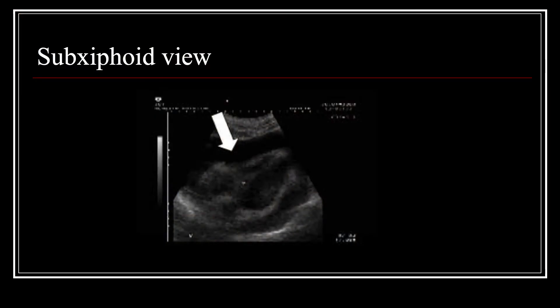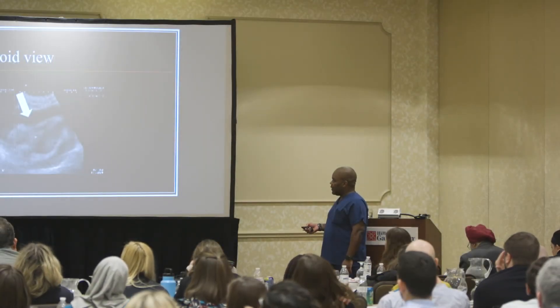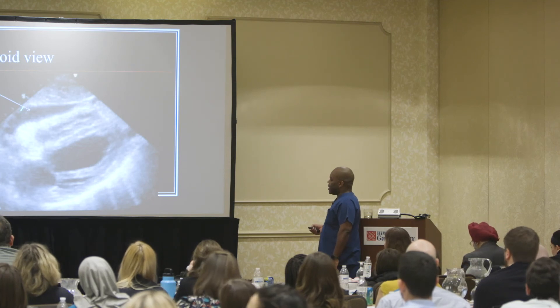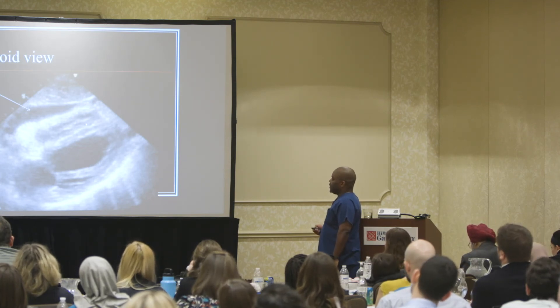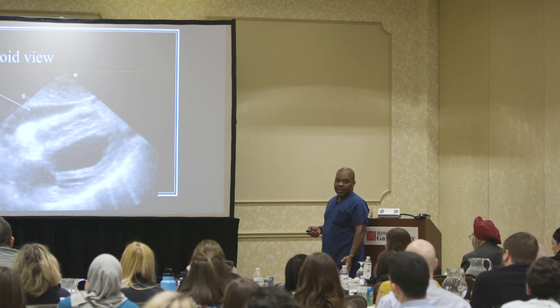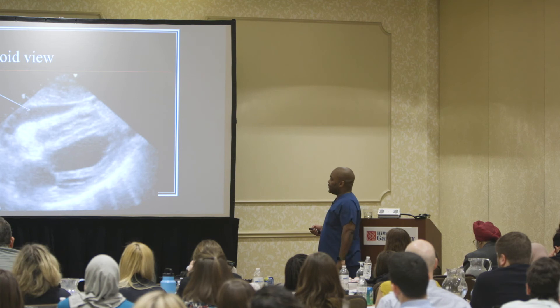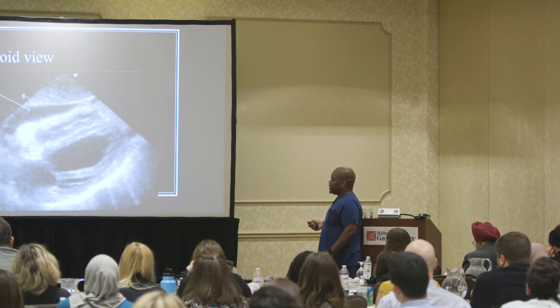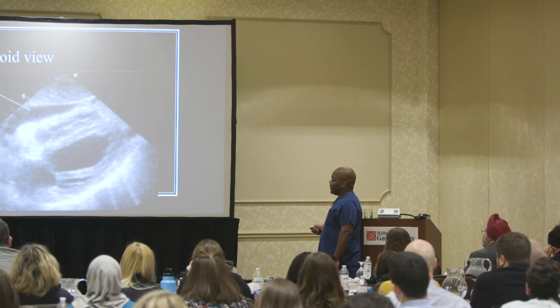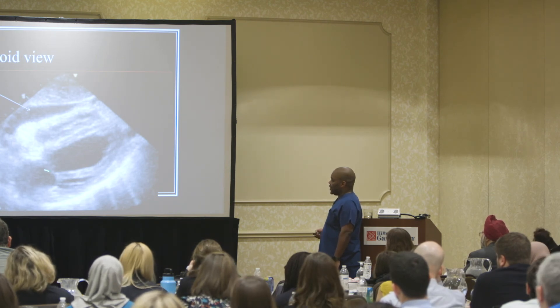Here's a sub-xiphoid view showing a very large effusion around the heart. You can see the right ventricle is collapsed and you cannot see the right atria at all. You can see the left ventricle and left atria. Here's an important point: tamponade is a clinical diagnosis — you cannot diagnose tamponade on ultrasound. You can say 'large effusion with right ventricle collapse and I cannot see the right atria,' but don't call it tamponade.